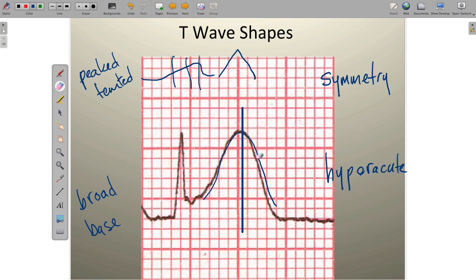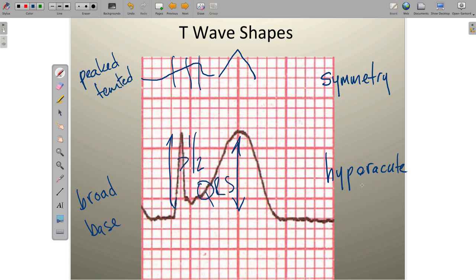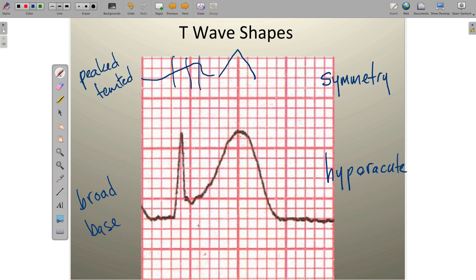Last but not least, we want to evaluate if the T wave size is hyperacute. When we talk about hyperacute T waves, we're talking about a T wave whose amplitude exceeds half the amplitude of the QRS complex. If it's greater than half the amplitude of the QRS complex, we refer to that as a hyperacute T wave. In this case, the T wave is actually taller than the entire QRS complex. So this illustration shows us a peaked or tented T wave, a T wave with a really broad base, a symmetrical T wave, and a T wave that is hyperacute. These four findings are critically important to recognize because they tell us about myocardial ischemia.